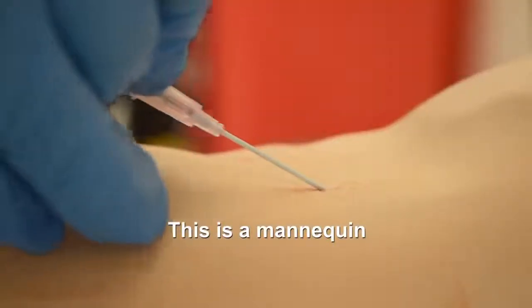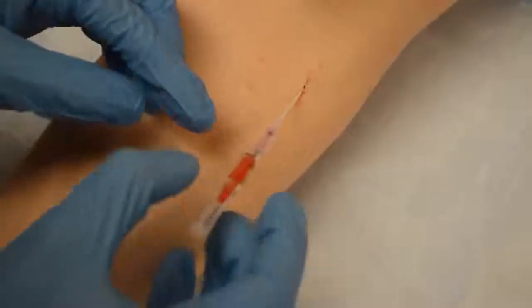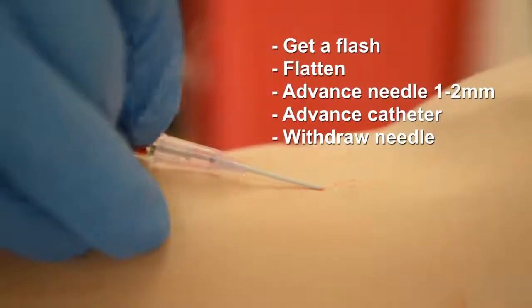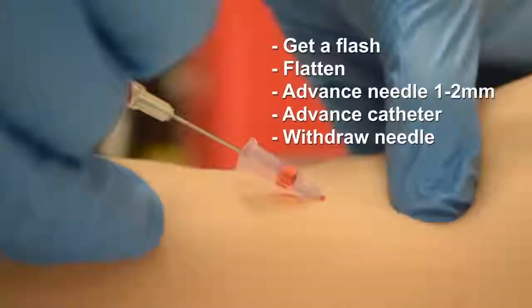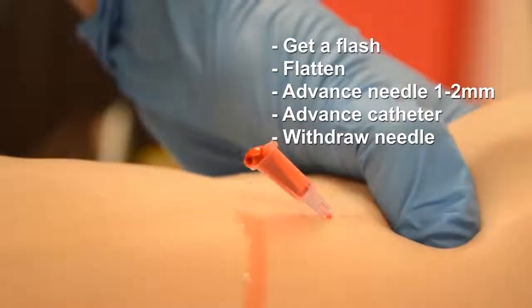So we're starting at an angle, get our flash, and this is what a flash looks like here. Flatten and move forward. Then advance our catheter. Pull our needle out slightly while putting tamponade on the patient and removing our needle, and slam dunk into our sharps.